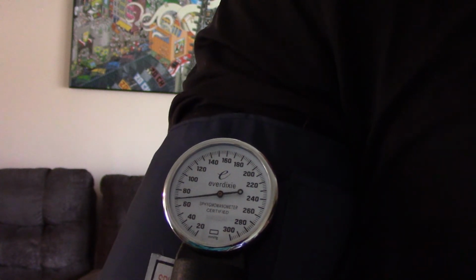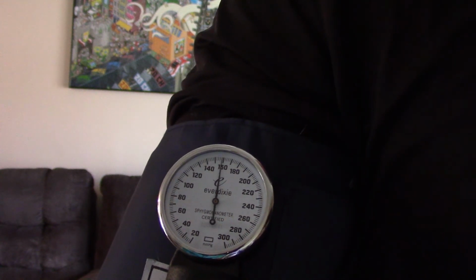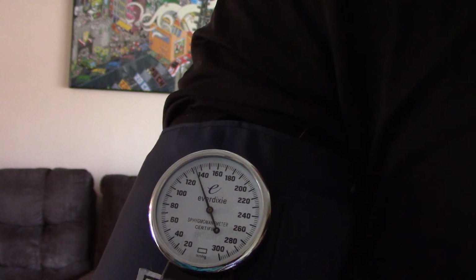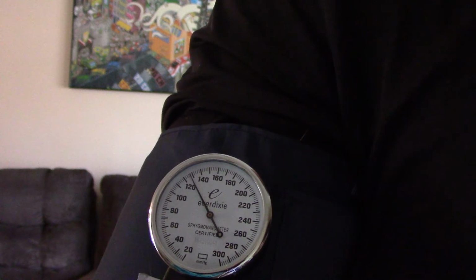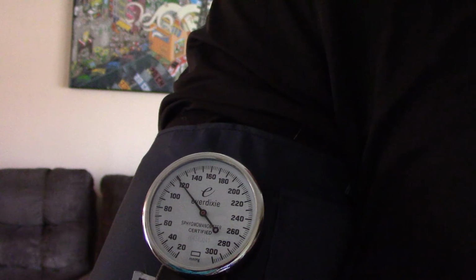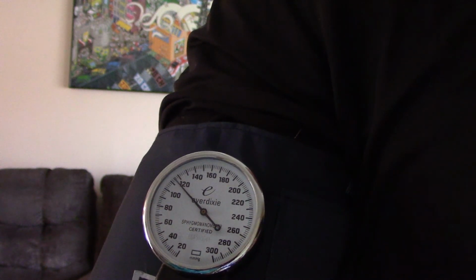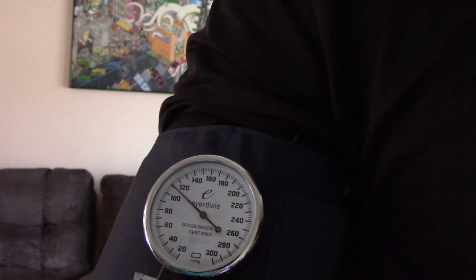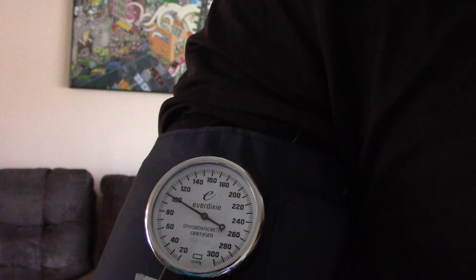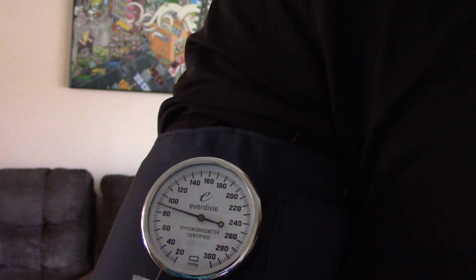And here's once that's way too slow. Okay. If the needle's moving at that pace, that's too slow right there. See how the needle's still falling, but my patient would be getting in more and more pain as this goes and would likely have an incorrect blood pressure reading. So we really want that needle to just fall steadily, sort of like that.